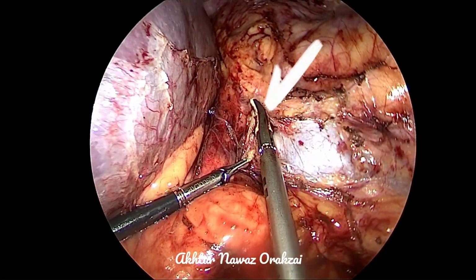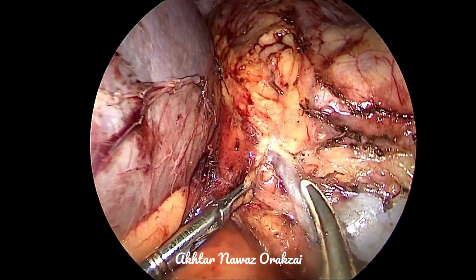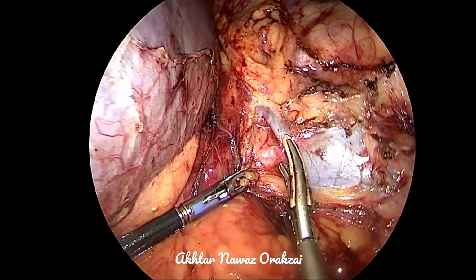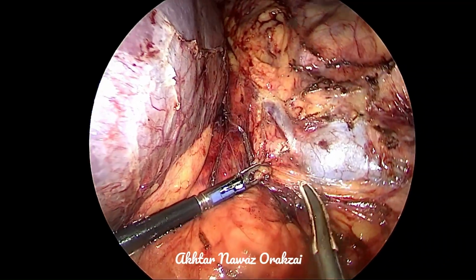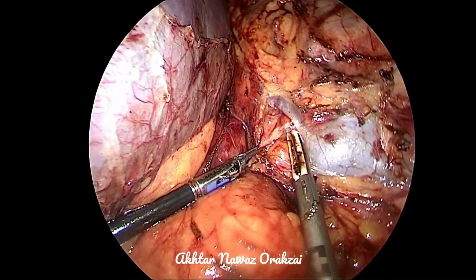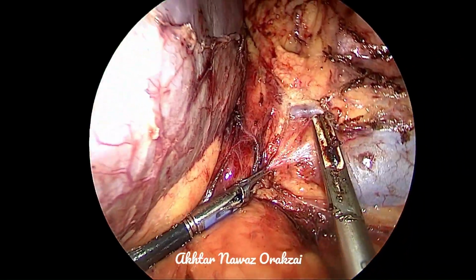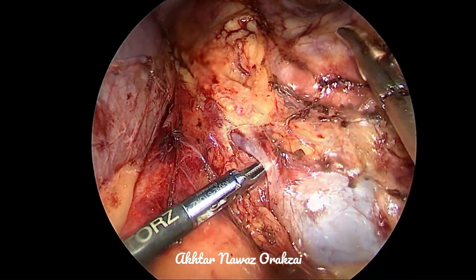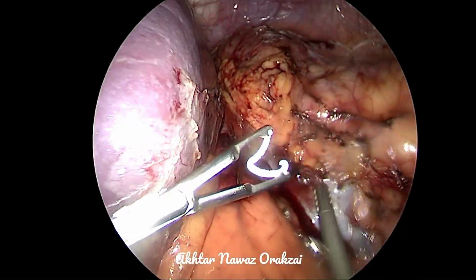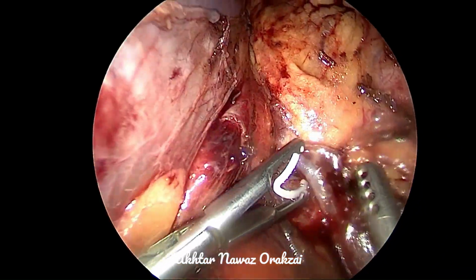So in case of pheochromocytoma, clipping of this vein before manipulating the adrenal gland is of utmost importance. As we all know, on the right side, this adrenal vein is draining into the IVC directly in 99.9% of the cases. However, there are some variations where even the right adrenal vein may drain into the renal vein. So we dissect this adrenal vein carefully with the small 5 millimeter right angle. And then we clip this vein.